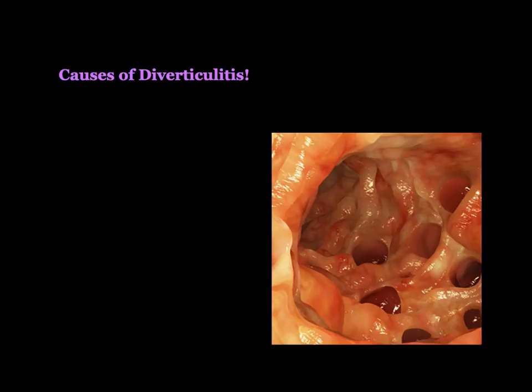Many, many more of those come to the emergency department, get a CT scan that demonstrates diverticulitis, and are well enough to go home and take oral antibiotics. Diverticulitis is a pretty common disease, and we perform a lot of CT scans. So wouldn't it be great if we could make this diagnosis using point-of-care ultrasound? We could reduce length of stay for patients in the emergency department. We could reduce CT imaging utilization, and thus cut our healthcare costs.